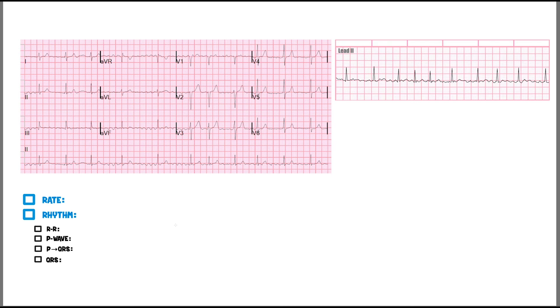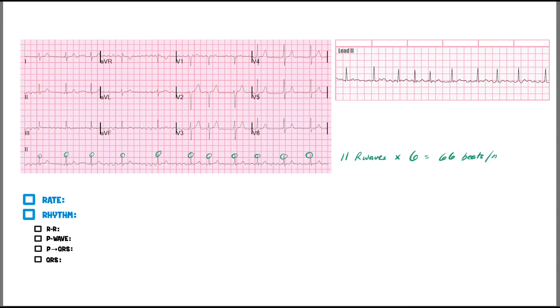On this EKG, let's start with the same process: rate. How do we determine rate? We have a rhythm strip, so let's do it that way. We count: one, two, three, four, five, six, seven, eight, nine, ten, eleven — so we have 11 R waves. Multiply that by six, which gives me 66 beats per minute.